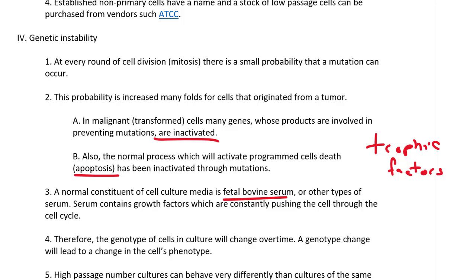So when you have your media, the regular media, which we'll talk about shortly, that is this reddish liquid that has all the carbohydrates, amino acids, cofactors, vitamins, buffer and pH indicator, and those good things that the cell definitely needs, you add the serum to that media to complete it. So you get complete media. Complete media has serum in it, so that now the cells have all the goodies they need to survive, meaning the food, the monomers and the cofactors, but they also have the signals coming into them to stay alive and also divide.